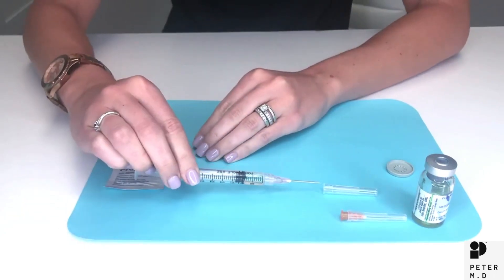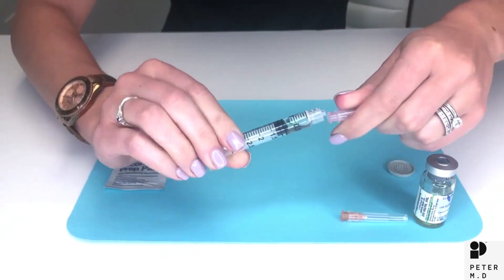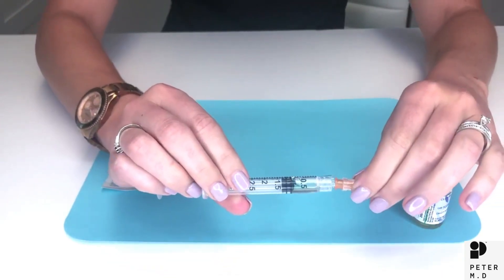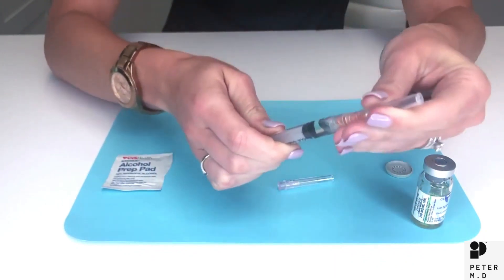Now carefully recap the needle by placing the cap on. Twist off the 18 gauge needle and twist on the 25 gauge needle. Again carefully uncap the needle.